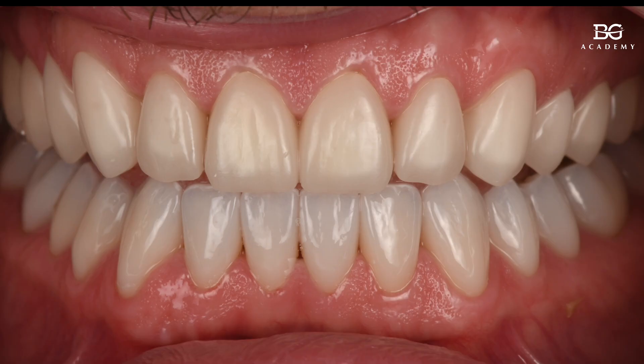To make the long story short from this particular case: this is actually a full mouth rehabilitation with 28 units, planned and executed in a certain way. Here we have the stage of the rehabilitation when the lower arch is already bonded — ceramic restorations on the lower teeth, 14 pieces of ceramic bonded — and we have the upper teeth.